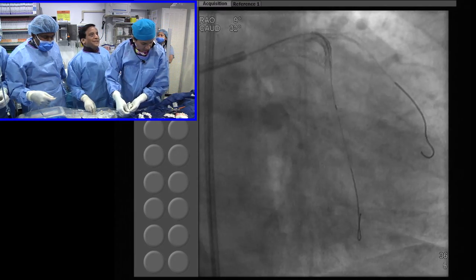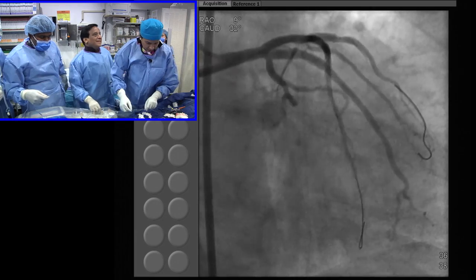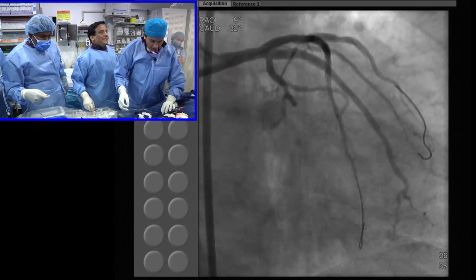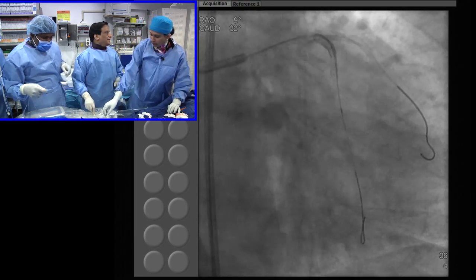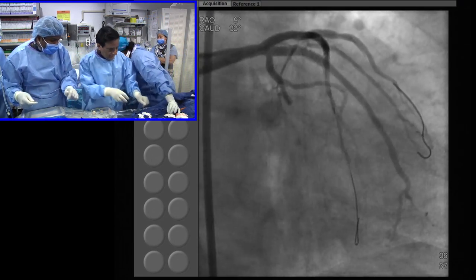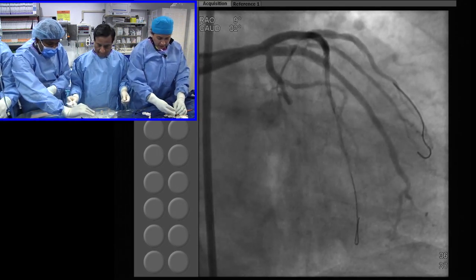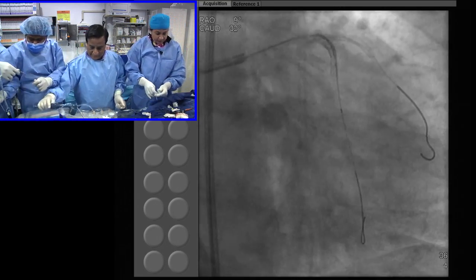Because this is more physician's time, hopefully there should be more reimbursement for putting in the absorbable scaffold. Yeah, look, I think more important, Anu's statement was exactly right from the previous series, that it requires much more patience, more time. The tower is done faster now.